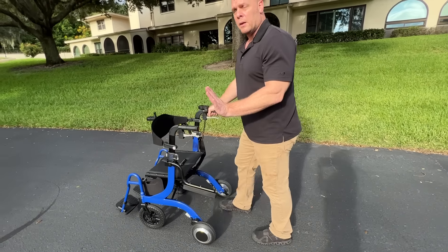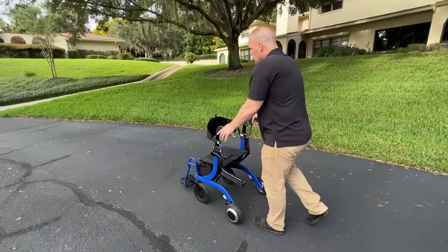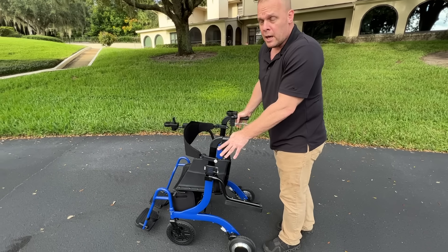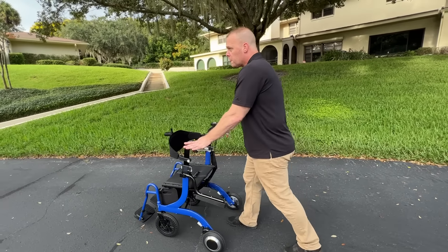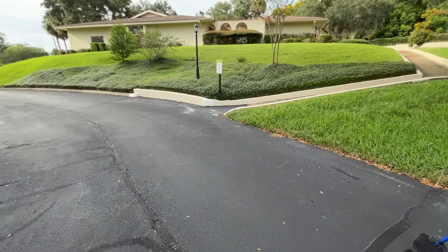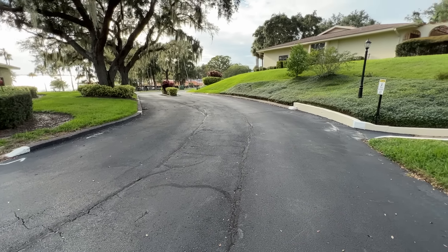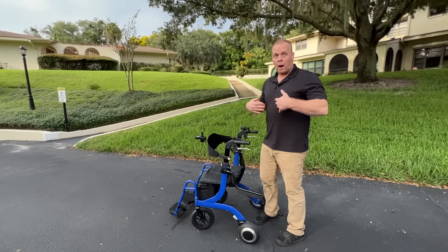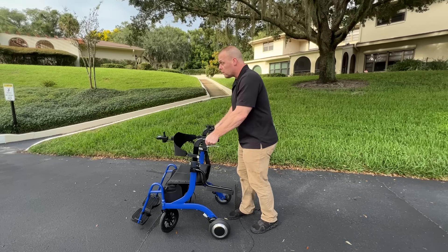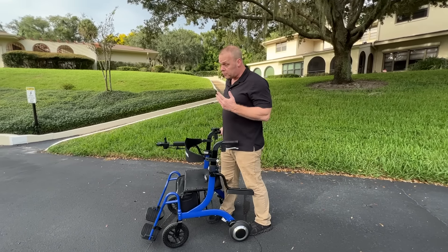Now I know that if you're a rollator user or if you've used a walker, one of the things about the walker is you've got the hand brakes. And if you're on terrain, the hand brakes are not a surefire way to really go about things. And if we take a look down here, I've got what can be an absolute nightmare. I don't know how well you can see it, but it's a decline — I'm going to go down. Basically now I have to use my body, and if I'm relying on a walker to help me walk, the last thing I want is to have this thing be absolutely no assistance at all. So I have to pull it back towards me — now it's a risk of falling. I'm thinking twice about taking a simple walk.